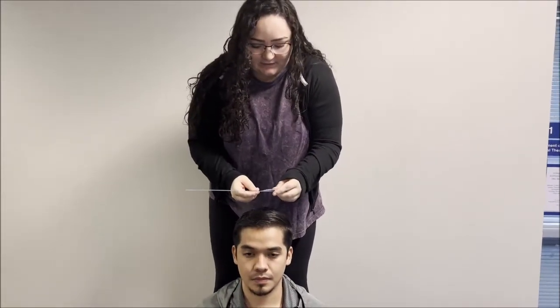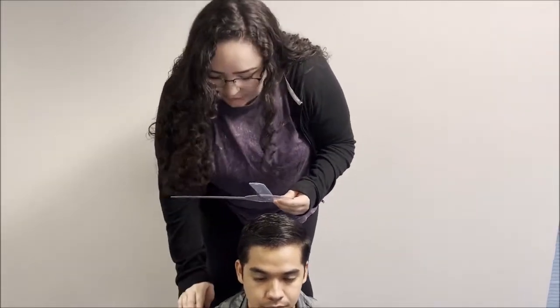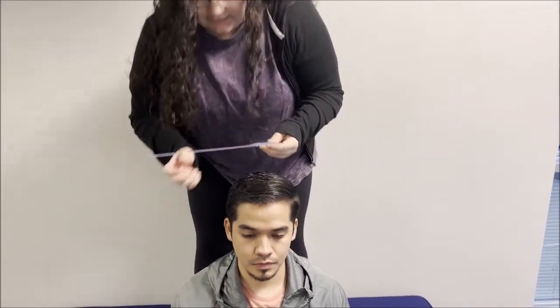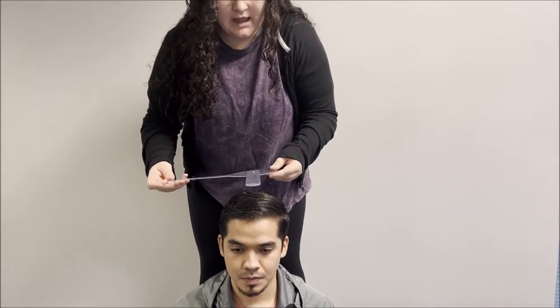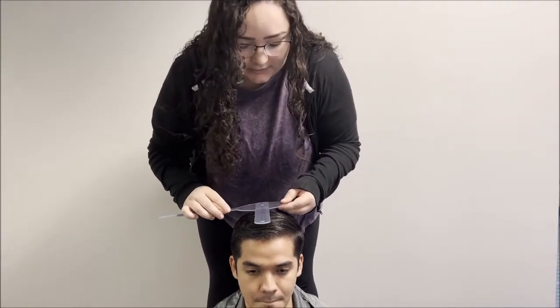Okay, so I'm going to take the fulcrum of my goni and place it on the superior surface of the center of his cranium. I'm also going to palpate his acromion, and that's going to be where the stationary arm is going to be, and the moving arm is going to be parallel with his nose.